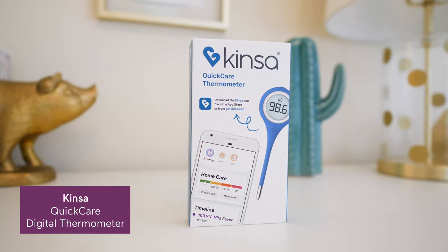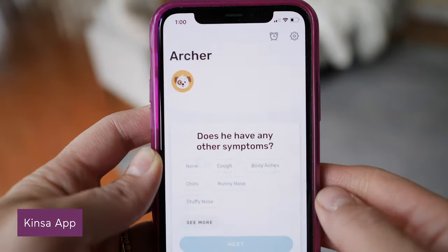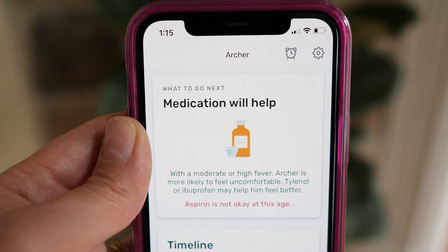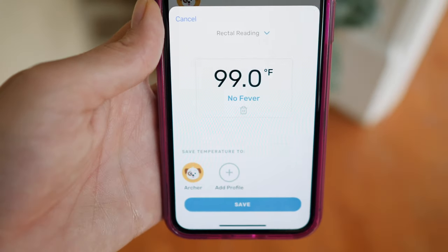If stats and data are more your speed, these smart thermometers take temperature readings to the next level. The Kinsa Quick Care Digital thermometer is similar to something like the Safety First digital thermometer. However, this one links to your smartphone via Bluetooth to give you guidance on what to do next via the free Kinsa app — for example, rest and fluids, ibuprofen, or a trip to the doctor. There's even a fun bubble-popping game to distract your little one as they wait eight seconds for that read.